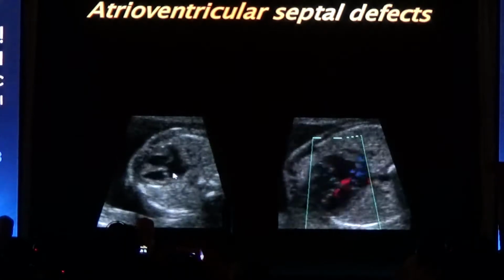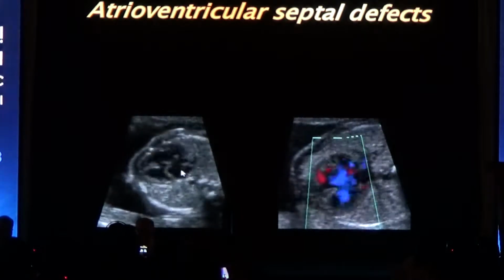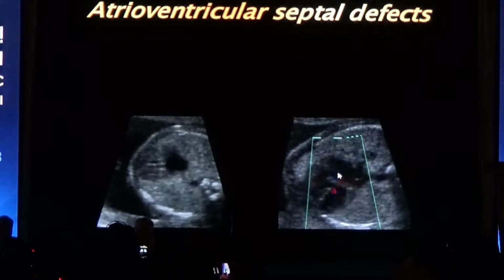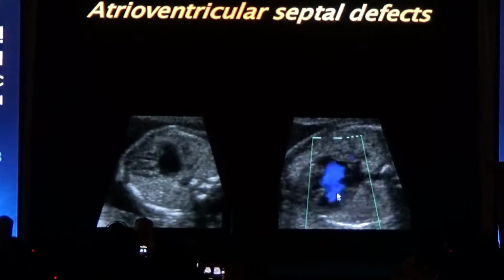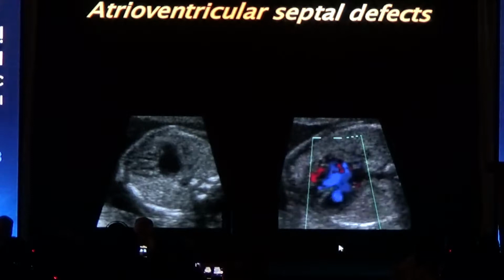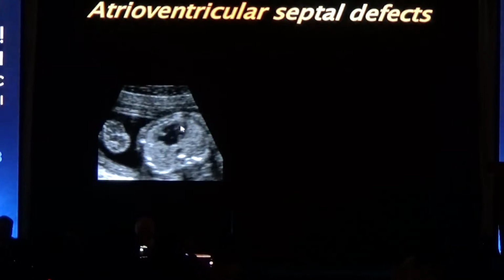You can see still part of the foramen ovale flap over. You almost don't see the interatrial foramen anymore. And you can see during diastole with Doppler that blood is going into both ventricles at the same time. So that makes the diagnosis quite easy. This is an early fetus. You can see the baby also has an important finding, the heart rate is too slow.